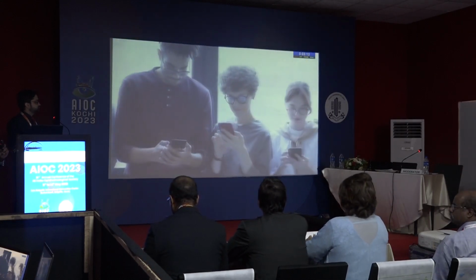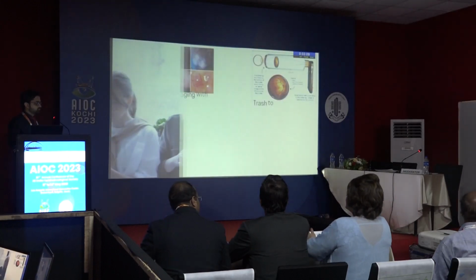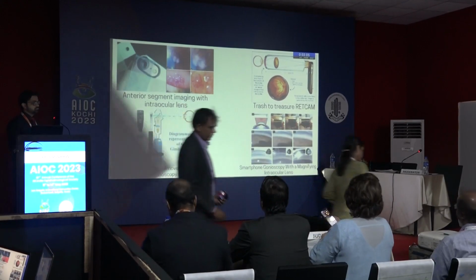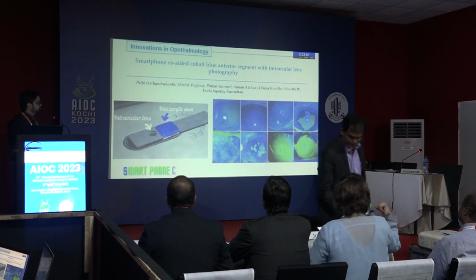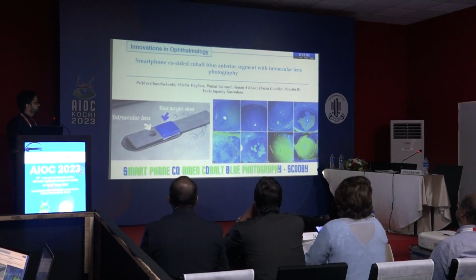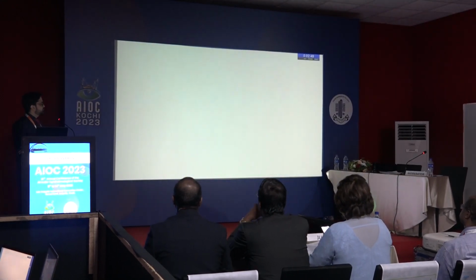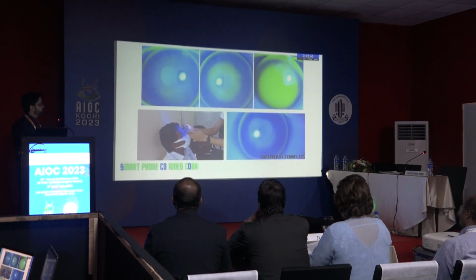Smartphones now run our lives, and we have seen smartphone-aided examination and documentation emerging as a new wave in modern-day ophthalmology. We have published a do-it-yourself device used in conjunction with smartphones for blue light photography of fluorescent-stained corneas, and this device was used to capture high-definition videos and images of multiple corneal pathologies. We extended its use to the world of contact lenses.